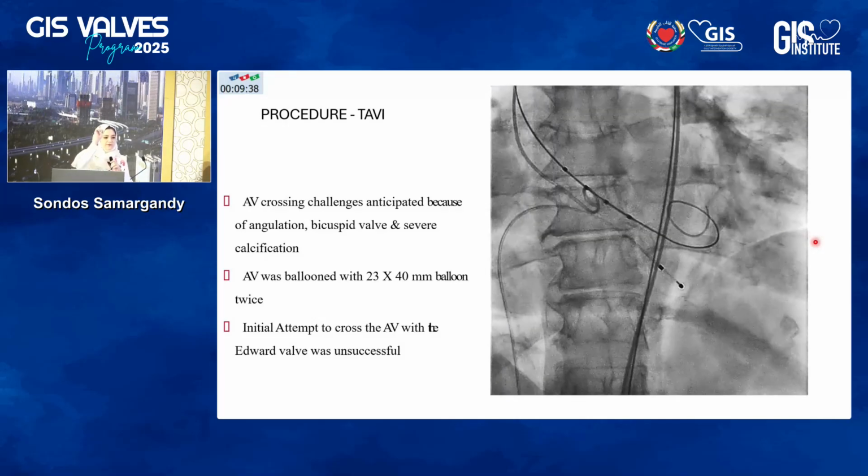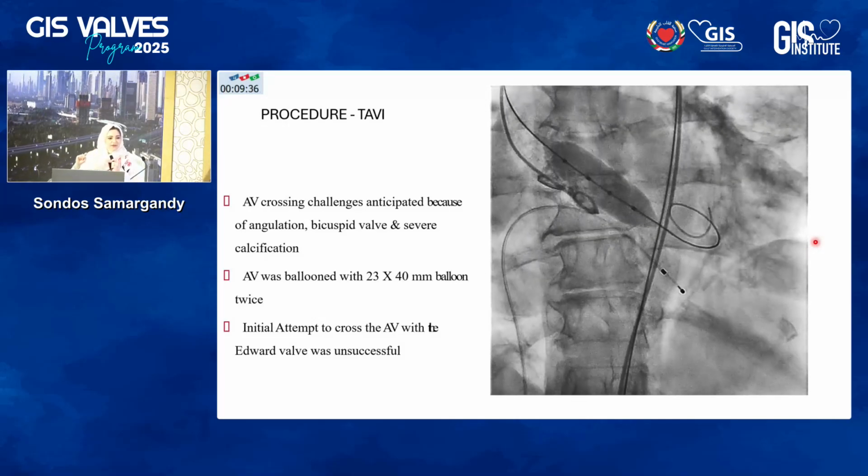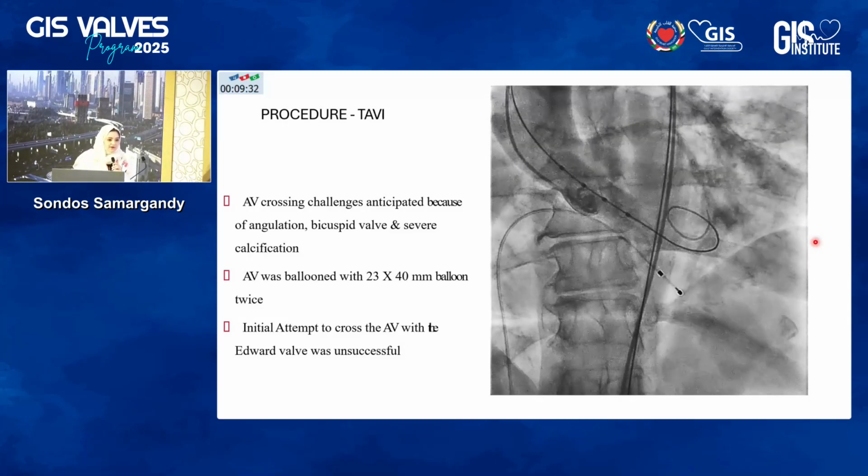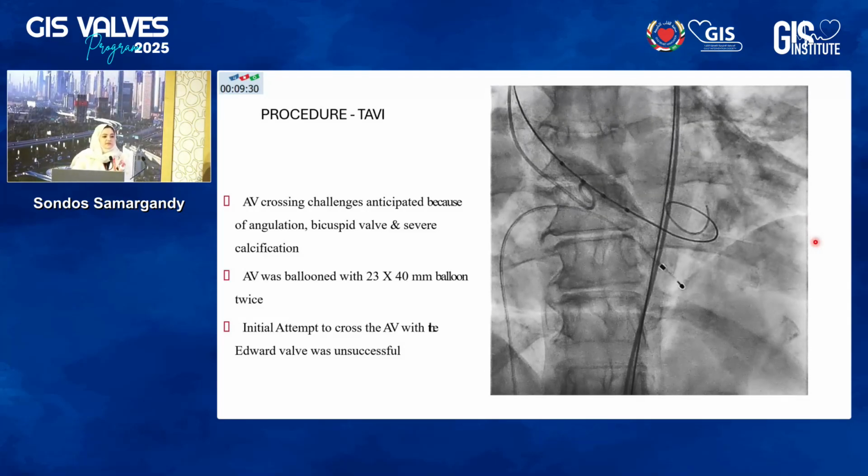So, Dr. Amri, I know I'm putting you on the spot, but do you routinely balloon in the bicuspid aortic valve, or is it on a case basis?